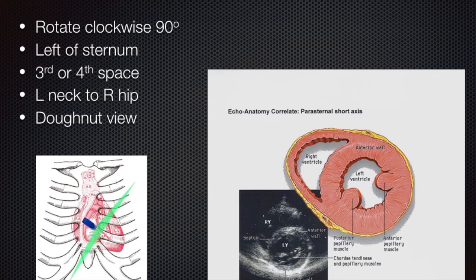With this one, I'll show you the three in a minute, but you can see there is a nice one which we call the dancing donut view, because you can see it's nice and round. That's the left ventricle. Then there's two bulges into the cavity of the left ventricle, which are the papillary muscles.